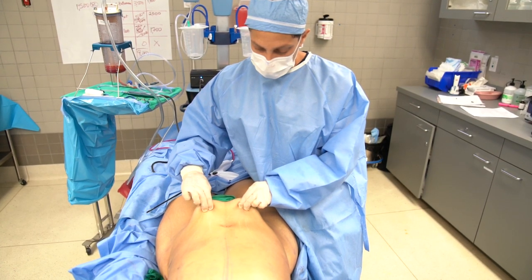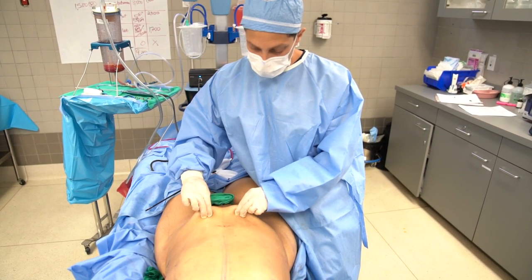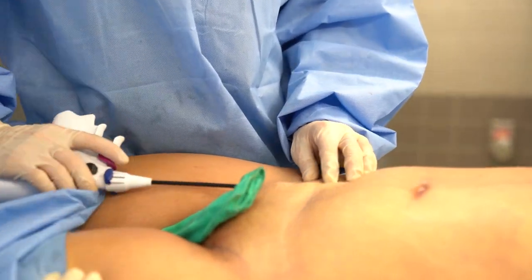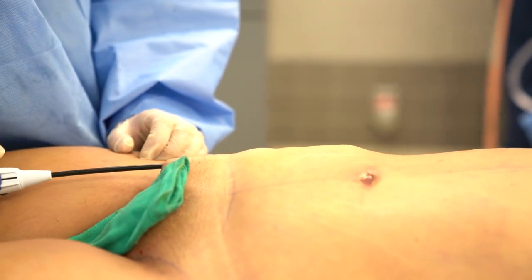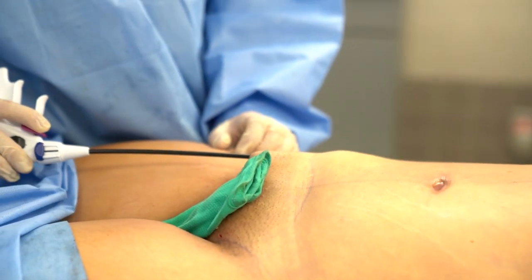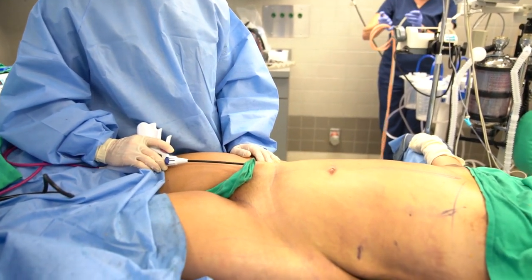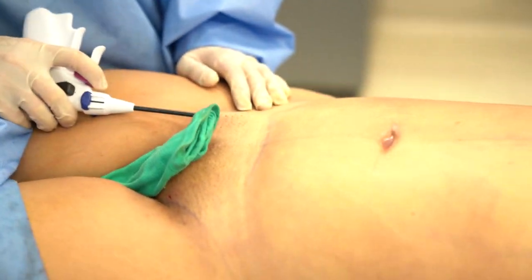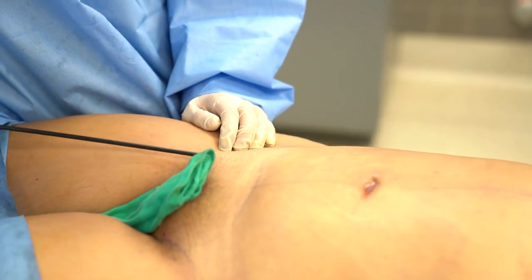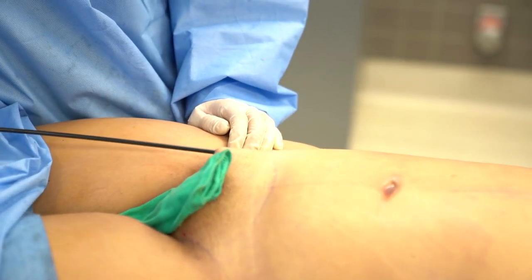This is going to be before J plasma. I'm going to pull up on the skin — this is the abdominal wall skin that is loose. We use the same incisions as lipo, come in, and then activate the device. We activate it at different depths with multiple passes: very close to the skin, a little deeper, then even deeper. This allows really maximal retraction of loose skin.